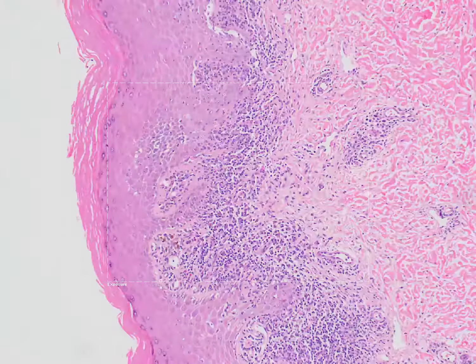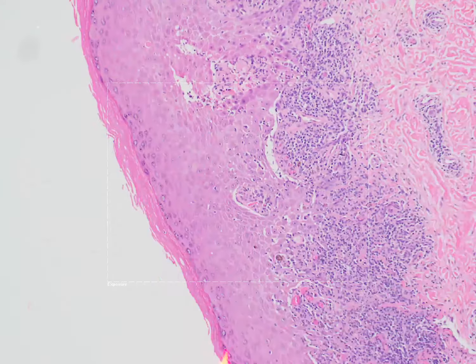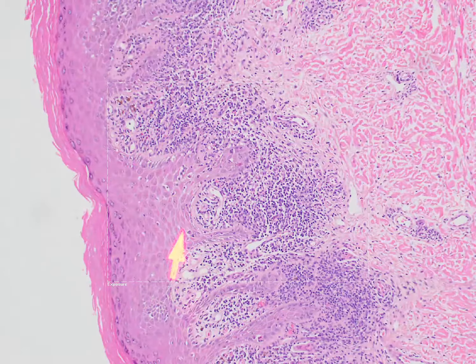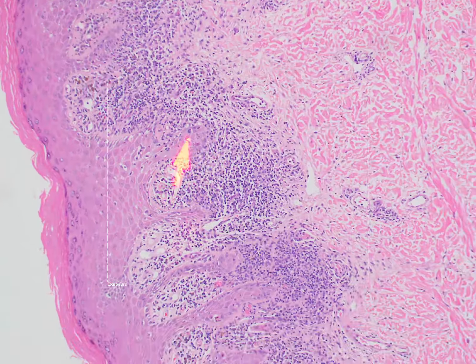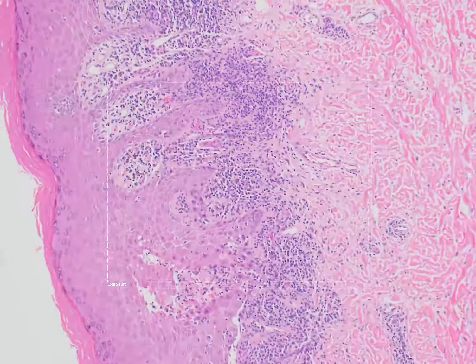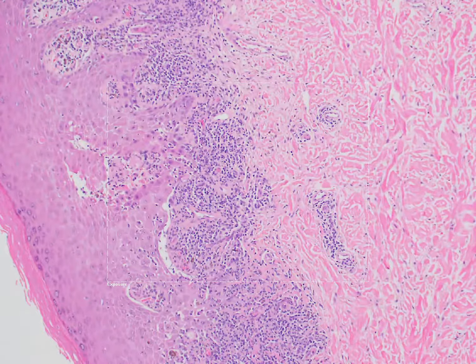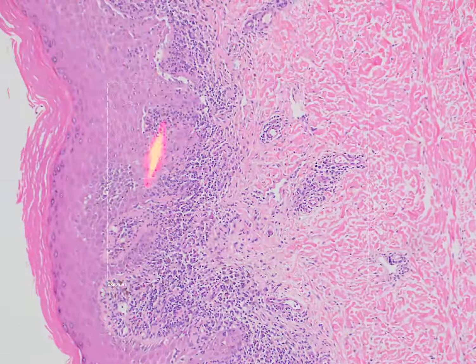The granular layer is thickened, so there's hypergranulosis. The epidermis is irregularly acanthotic, and the rete pegs have the distinctive quality of being thinned, and in some areas might be described as sawtoothed in appearance. There is a heavy lichenoid or band-like, predominantly lymphocytic infiltrate along the dermal-epidermal junction.